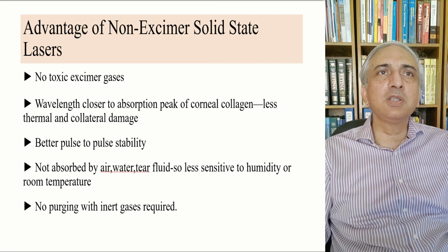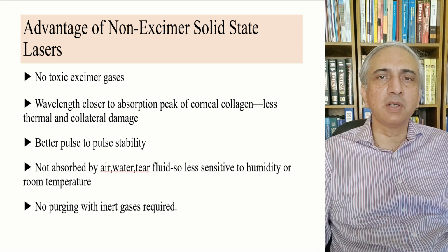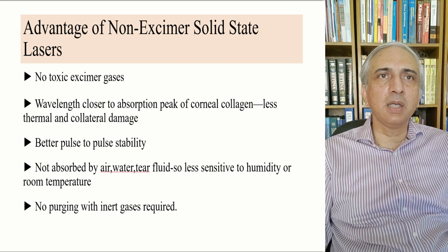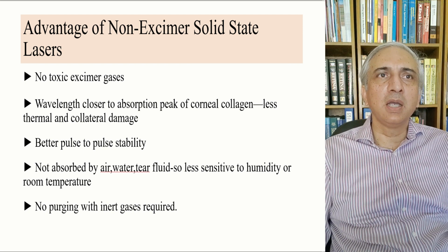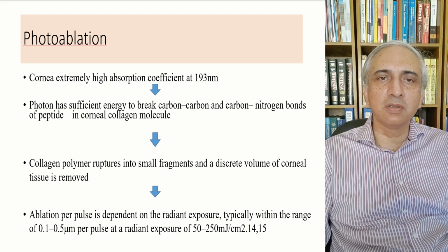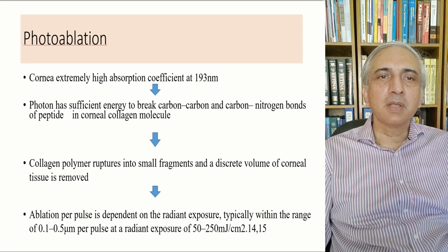The advantages of non-excimer solid state laser is there's no toxic excimer gas, wavelength closest to absorption peak of collagen, less thermal and collateral damage, better pulse to pulse stability, not absorbed by air, water, tear fluids, so less sensitivity to humidity or room temperature, and no purging with inert gas required. Although these are the advantages, still currently the norm of treatment which is preferred by the refractive surgeons is argon fluoride, the traditional excimer laser.